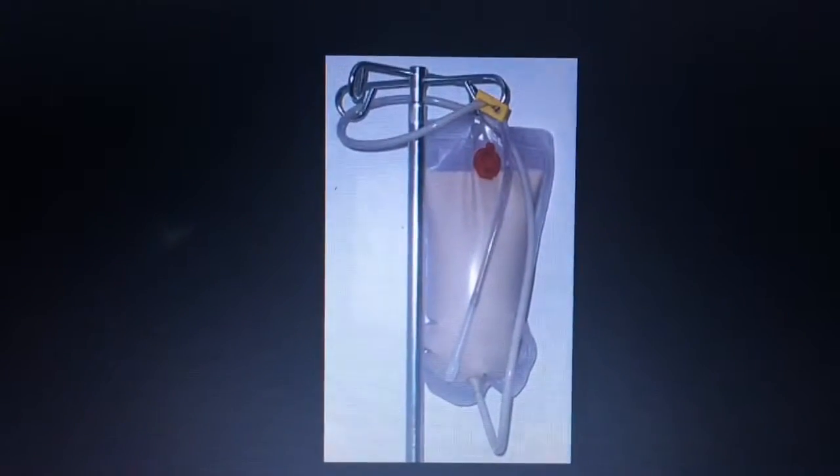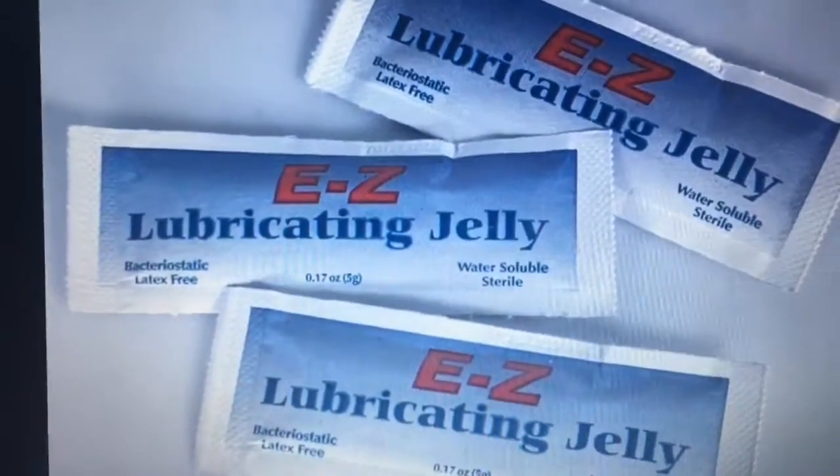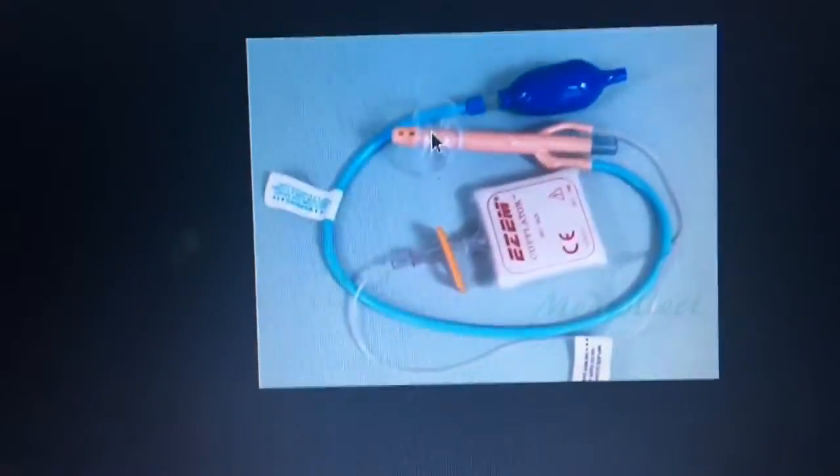This is the bag. It's hung 24 inches above the fluoro table, and that's barium in there. We fill it up to 1,000 mLs. And this is the lubricant jelly that we applied to the tip. We also have towels and gloves that we use.